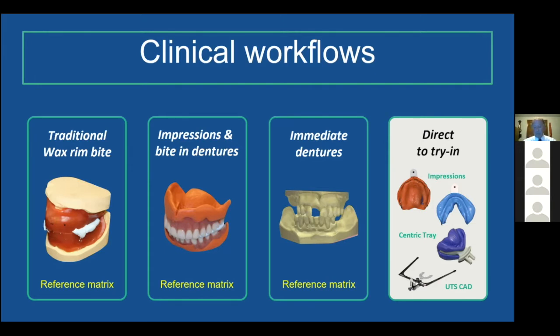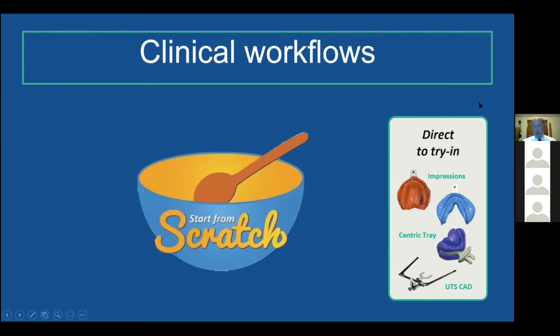Unfortunately, with the workflow we're going to describe, this is where we start from scratch. Now, why do you want to start from scratch? I don't want to start from scratch anymore, personally. If a patient has dentures, that's where I'm starting. I'm going to duplicate those dentures, and that's where I'm going to start. That probably is going to cover at least 80% of people who walk in your office, who have existing dentures.